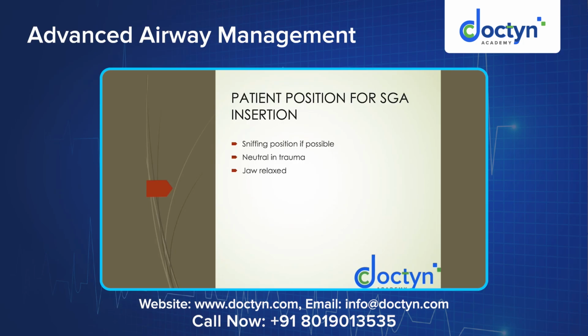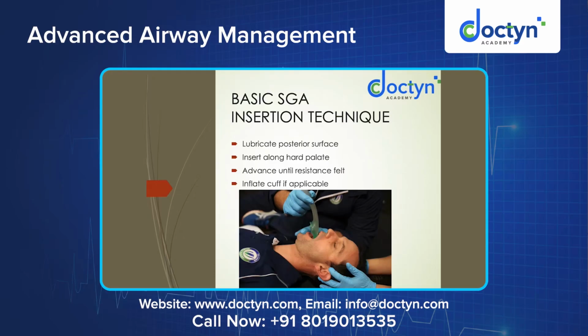The jaw should be relaxed. Lubricate the posterior surface. The posterior surface is this surface. Lubricate it because this usually passes along your hard palate, so that's why it needs lubrication. Insert along the hard palate, sit it against the hard palate and insert it. Then the soft palate comes, and again there will be a giveaway.